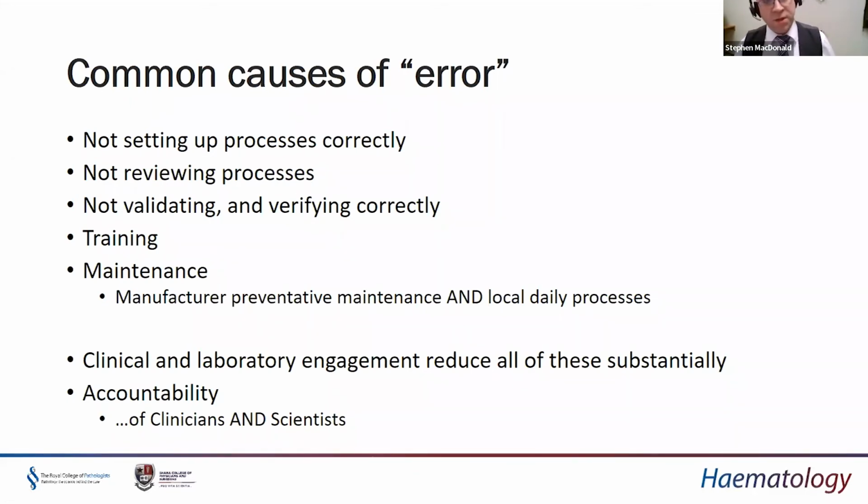And what we find now is that, particularly for those laboratories that are using techniques that have been around for a long, long time, what was acceptable when they were first implemented might not be acceptable now. And setting things to the same standards that they were in the 1950s, 60s, 70s is not the same as what we're looking for in 2022. So part of the periodic review of our examinations in the context of the clinical requests is considering re-verification of methods based on the changing landscape of tests that we do.